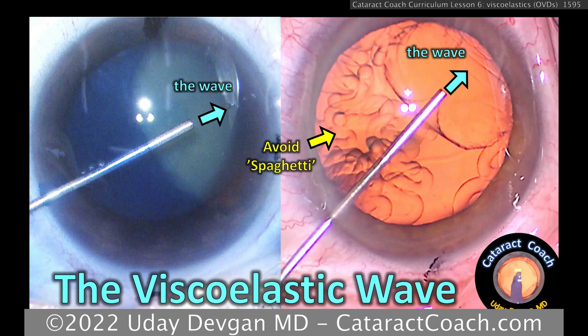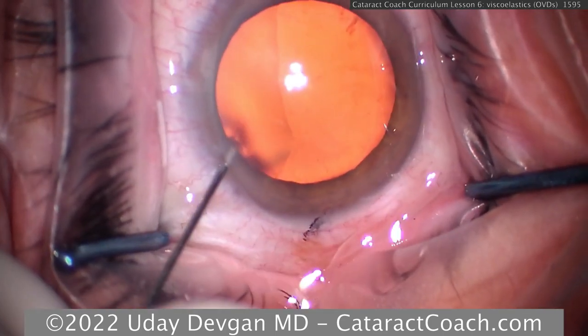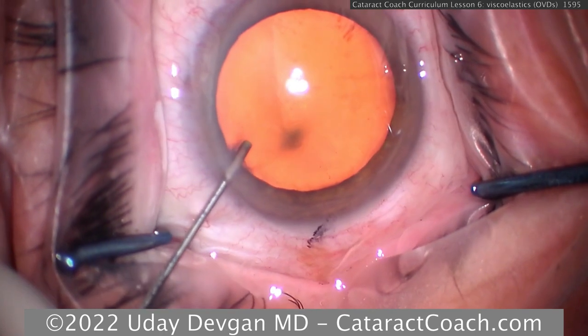CataractCoach.com, the viscoelastic wave. We want to avoid the spaghetti. We actually want a nice clean wave. What do I mean by that? Well, we have a routine cataract case here. We're putting anesthetic inside the eye.